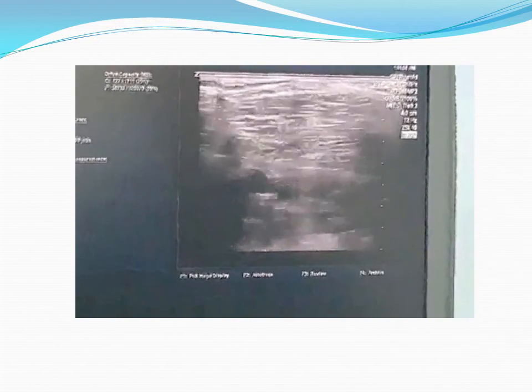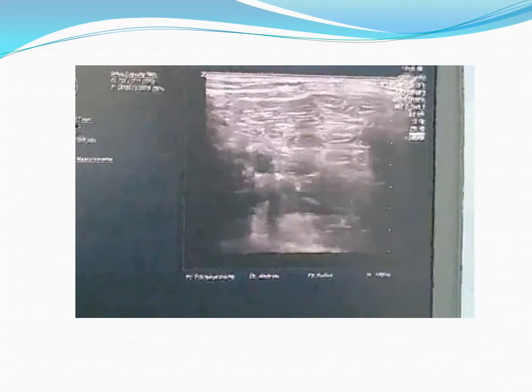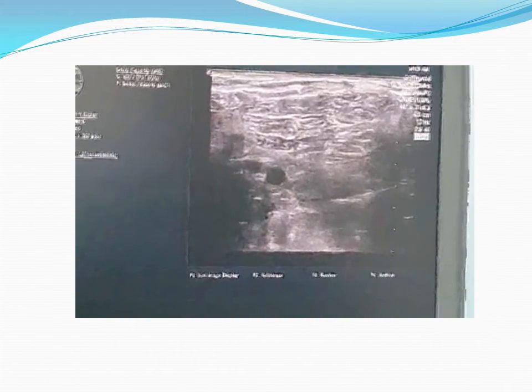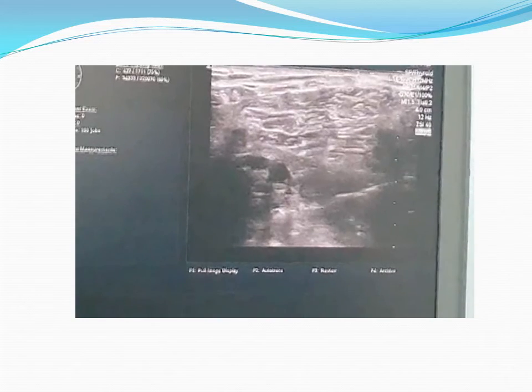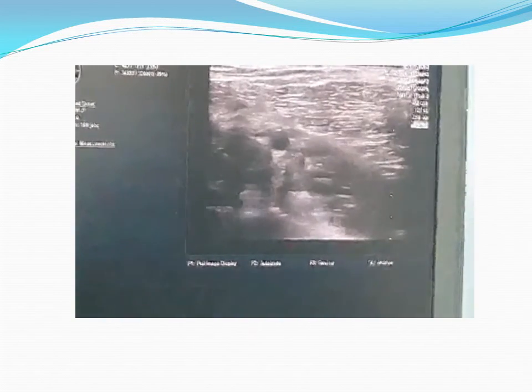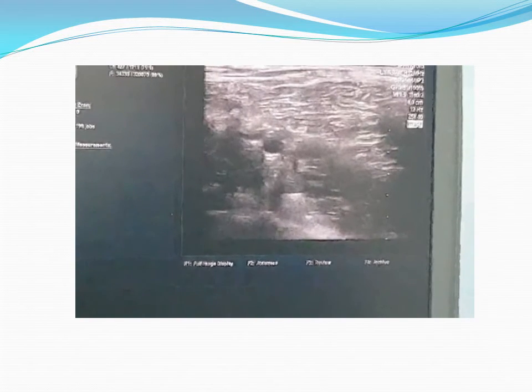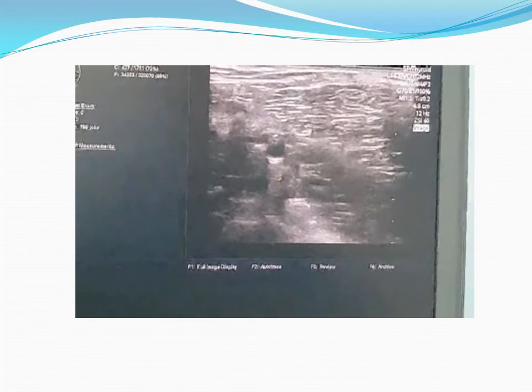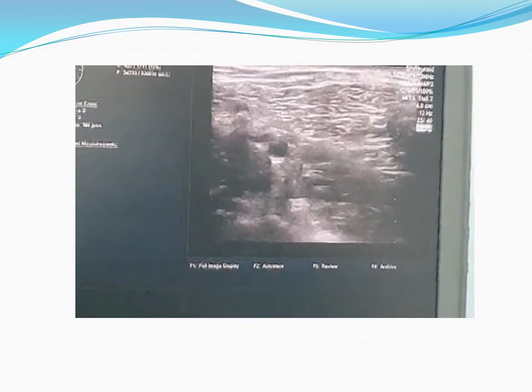Now, yeah. Now inject. Inject. Inject. Yeah, this is the lateral injection between the capsule and the popliteal artery. Can I give the full dose? Give full dose. Thank you. Done.